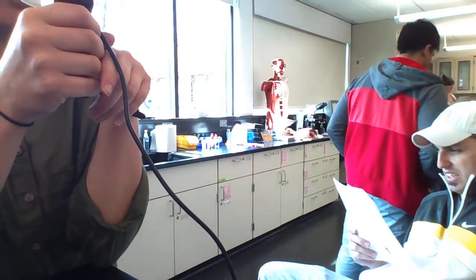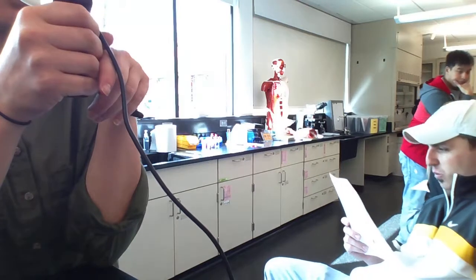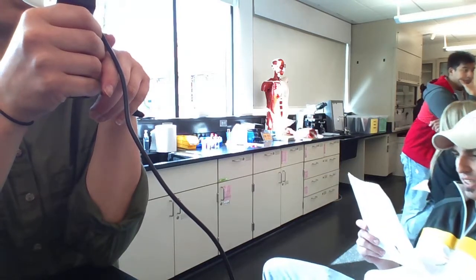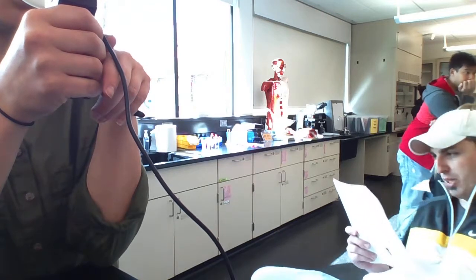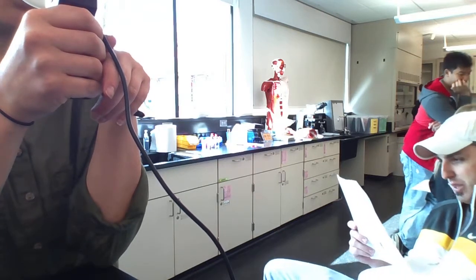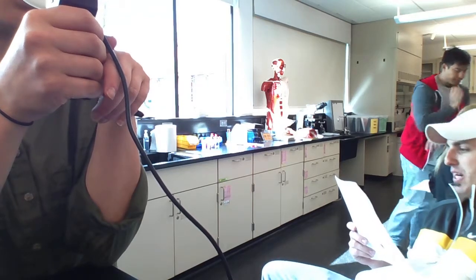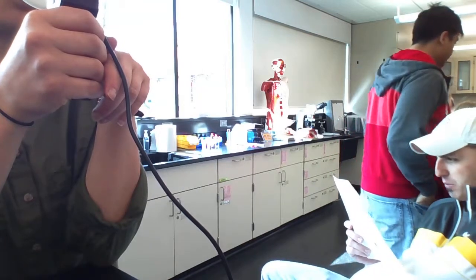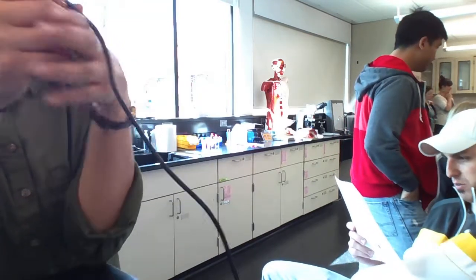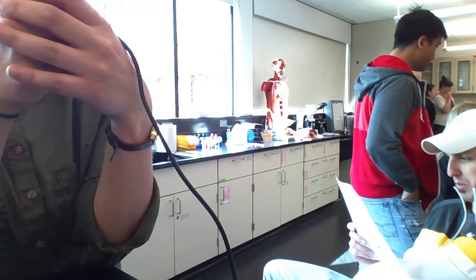And you'll start data collection after 30 seconds. Take a normal breath in to begin data collection with an inhalation and continue to breathe in and out for 4 cycles. Inspiration and expiration. Fill your lungs as deeply as possible. Maximum inspiration. Exhale as fully as possible. Maximum expiration. It's essential that maximum effort be expended. Follow this with several recovery breaths until you're breathing normally again.